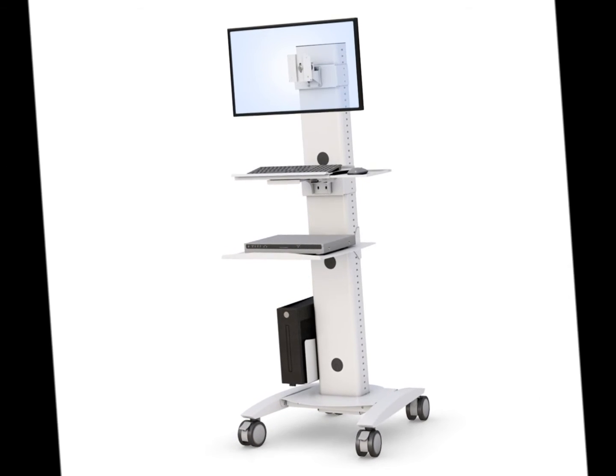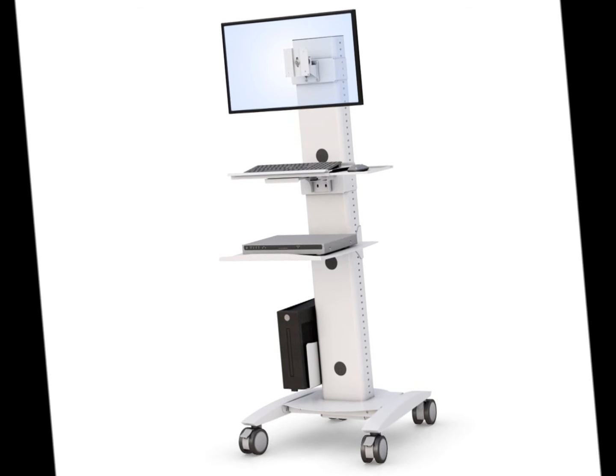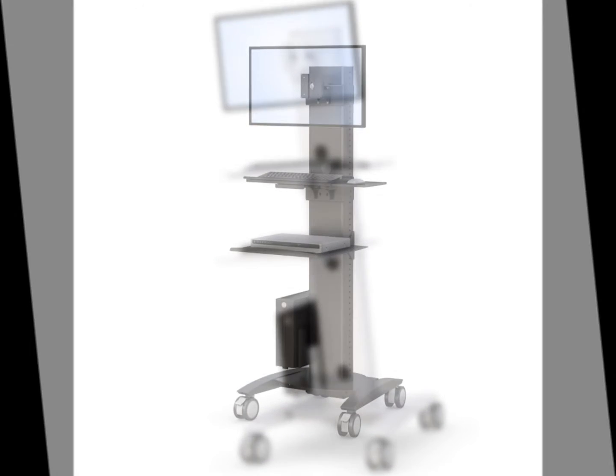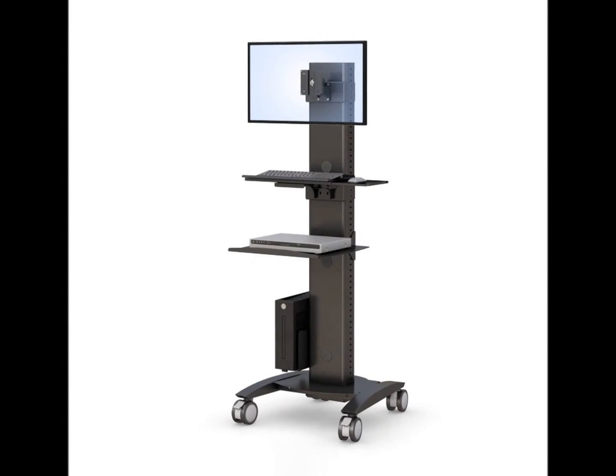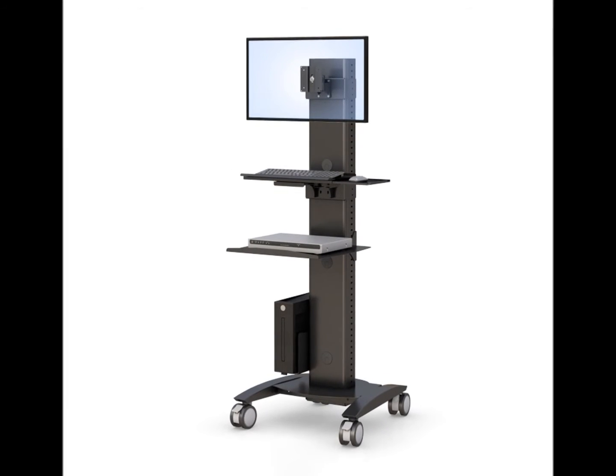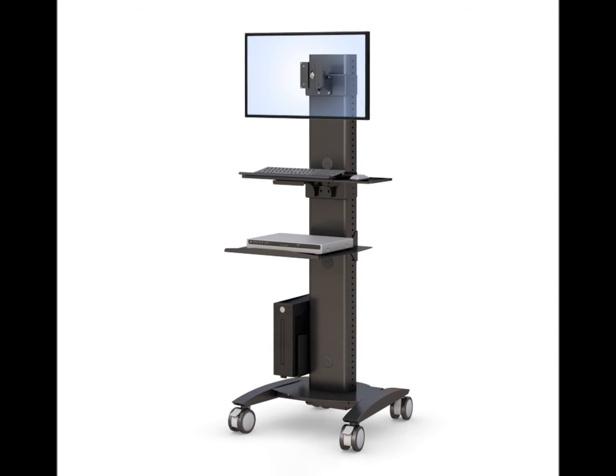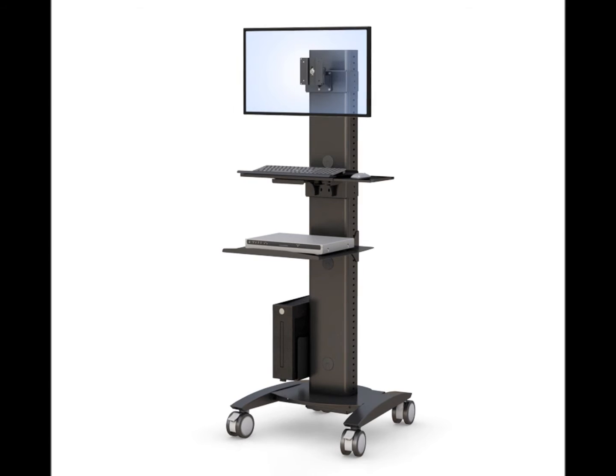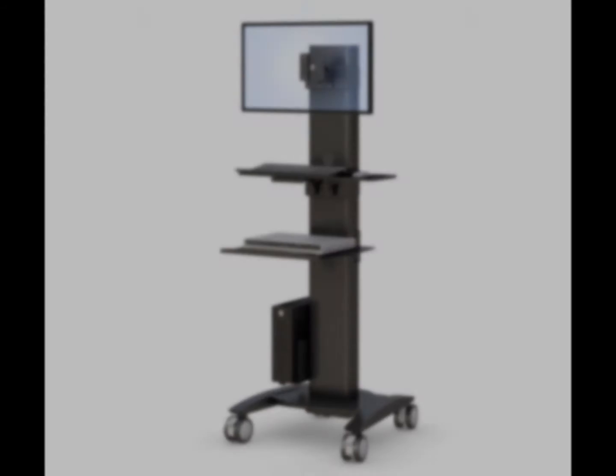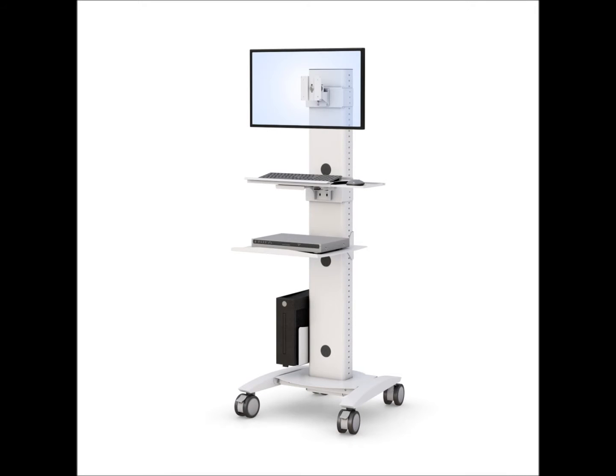This rolling medical computer stand is equipped with VESA monitor display mounting bracket, keyboard and mouse tray, printer tray, universal adjustable CPU holder, heavy-duty twin casters, and sturdy anti-rust coated metal frame.